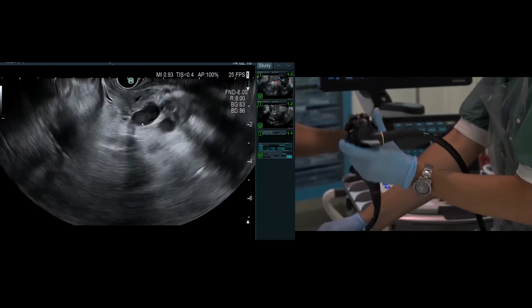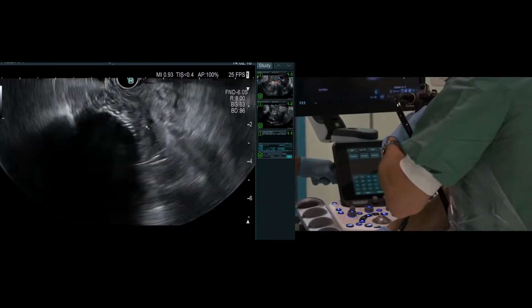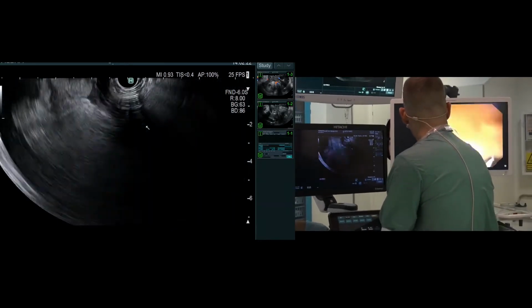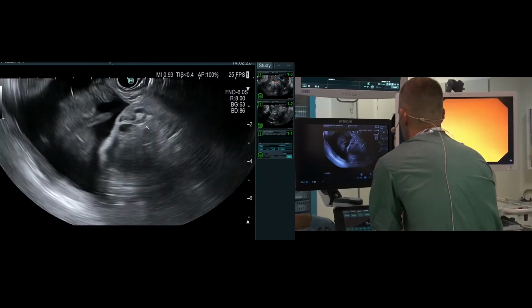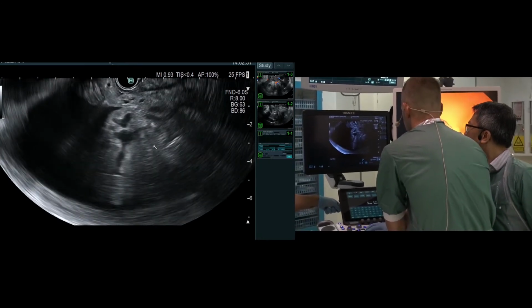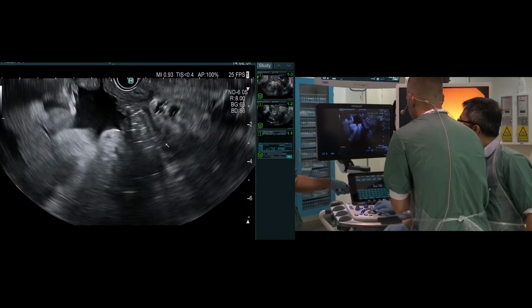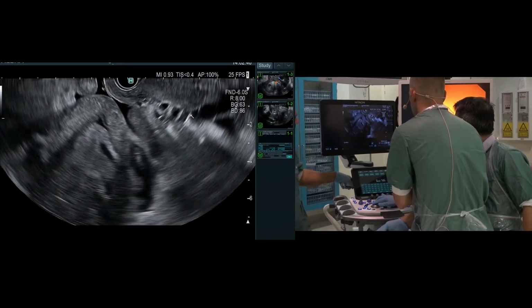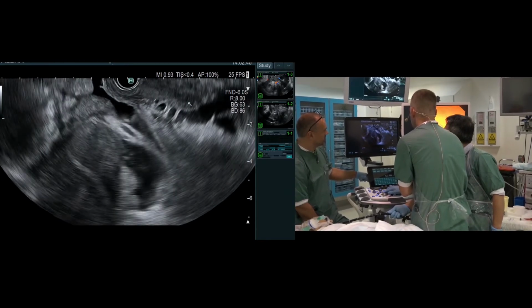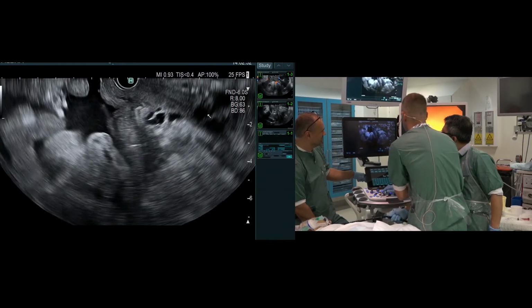it's dilated, and if we enter the descending duodenum to finish the demonstration, then you will be able to see the dilation of the duct. You will see the tumor again, and we see plenty of ascites here. Now, when withdrawing slowly the endoscope, the tumor will come here on the right hand side. It's coming, and you see the... So right above the tumor, there we have this dilatation of the PD, which is an indirect sign of obstruction and cancer being present there.